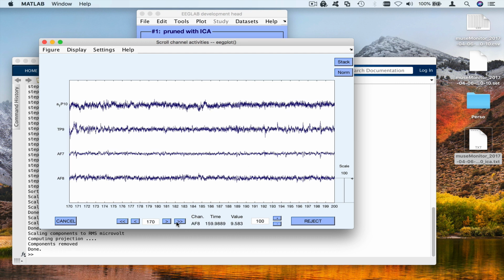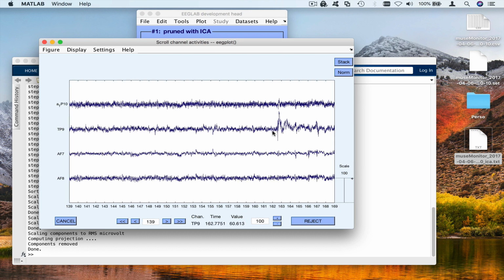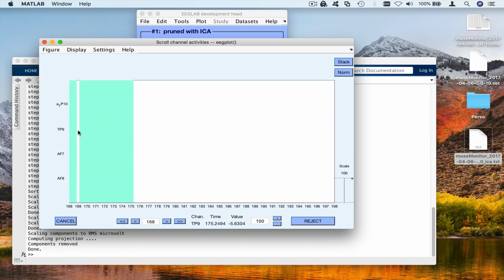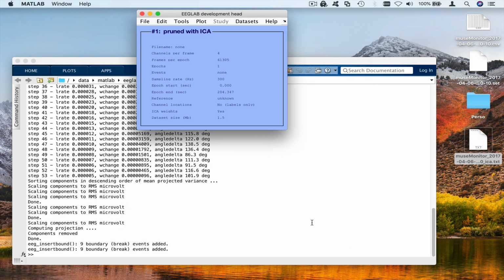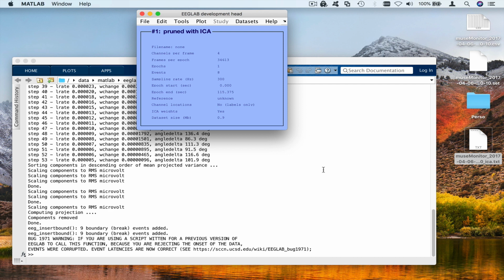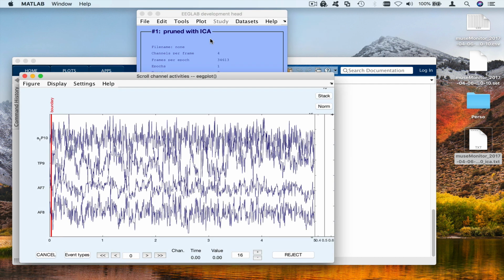And here, so yeah, it's better to remove too much than not enough. Okay, I press the reject button. And okay, now I'm going to double check a second time.